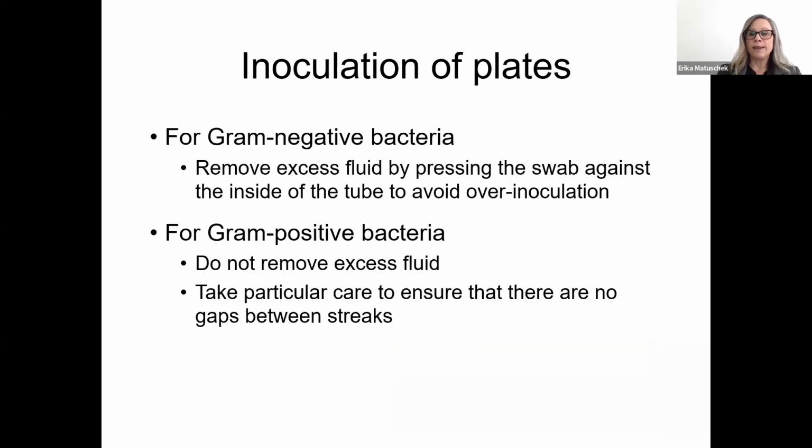The inoculum is standardized in the way that it should be McFarland 0.5, which corresponds to a specific, or rather an approximate, amount of bacteria. But we still have to inoculate plates a little bit differently depending on which organisms we test. So in general, we have these recommendations.